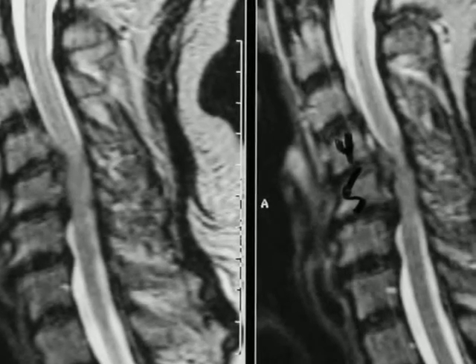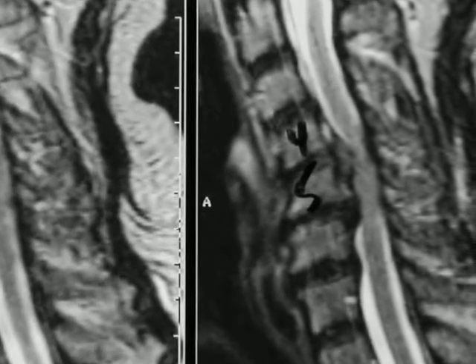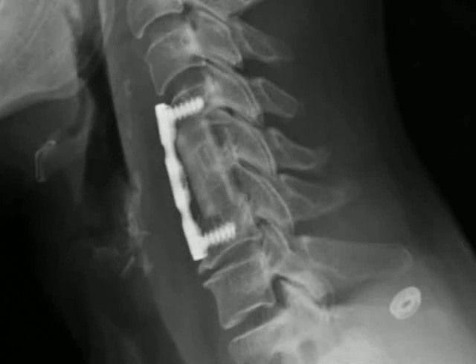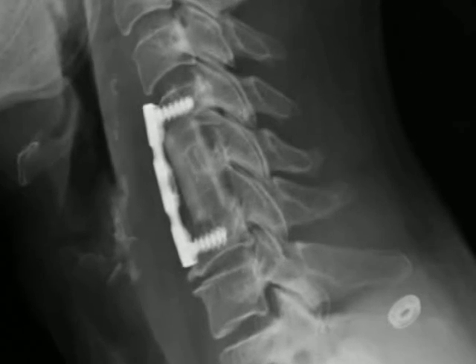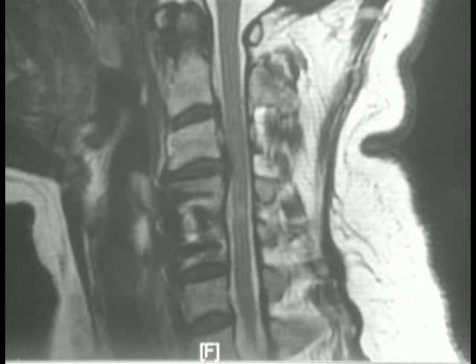This is another MRI scan demonstrating degenerative changes and disc herniation at the C4-5 and C5-6 level with significant spinal cord compression, and as well this patient needs an operation. This is the same patient after placing a longer bone strut with a plate spanning the area from C4 to C6 with the spinal cord decompression. This is a post-op MRI scan demonstrating the same patient after the spinal cord has been decompressed, noting the now room for the spinal cord to pass at the levels that were operated on.